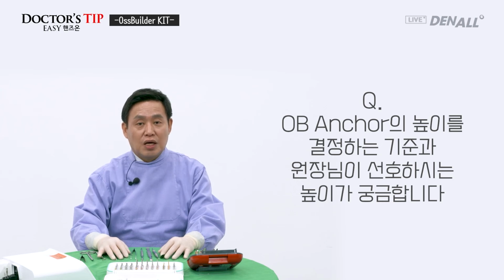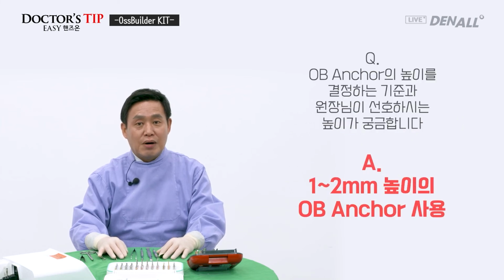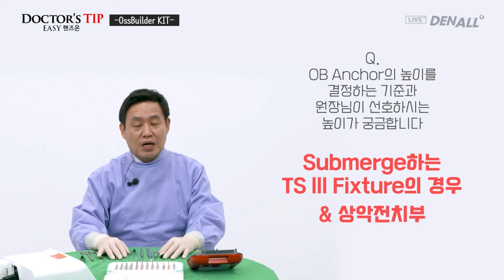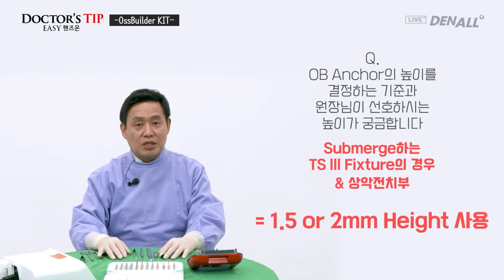When we place in the upper anterior, the TS implant is placed deep for aesthetic prosthesis, so overall I tend to place implants deep. Therefore, in my case, OB anchor height should at least be 1 millimeter or somewhere around 2 millimeters as well. At today's hands-on, anchor height of 1.5 millimeter was used, and I normally use 1.5, 2.0 OB anchor. Basically, submerged implants like TS3, I tend to place it more deeply, especially in the upper anterior region. If necessary, in the upper anterior region, I would use 1.5 or 2 millimeter anchor.